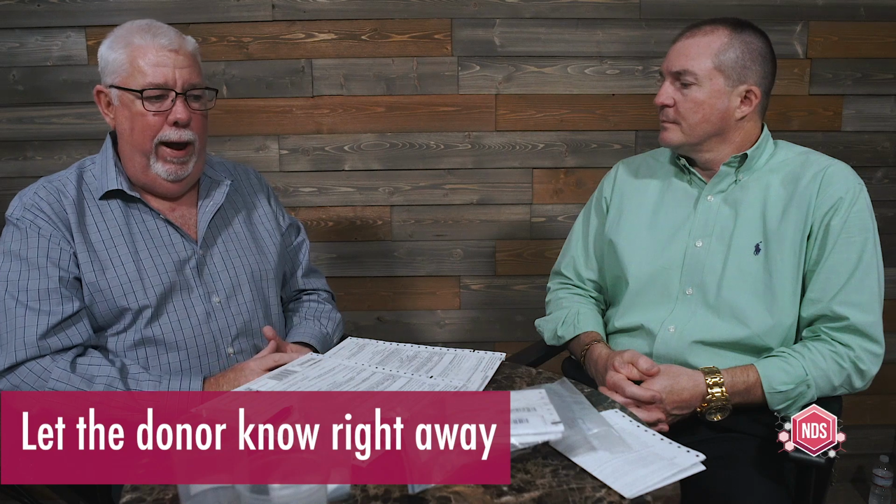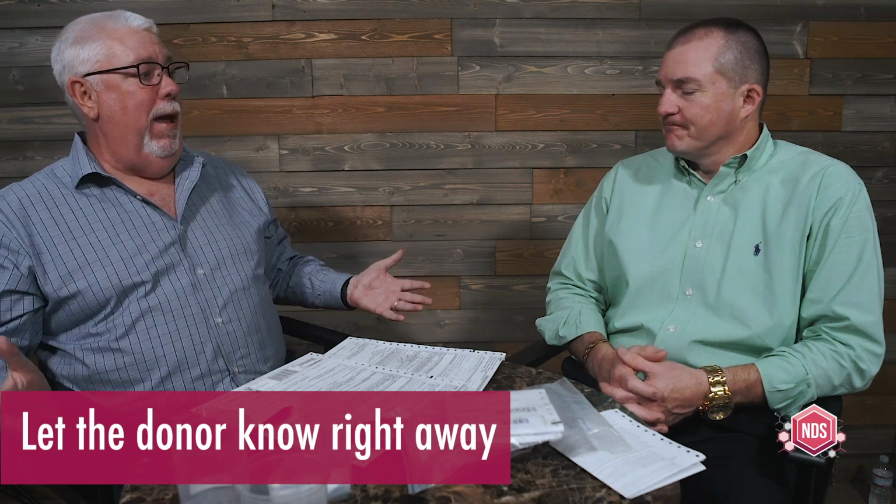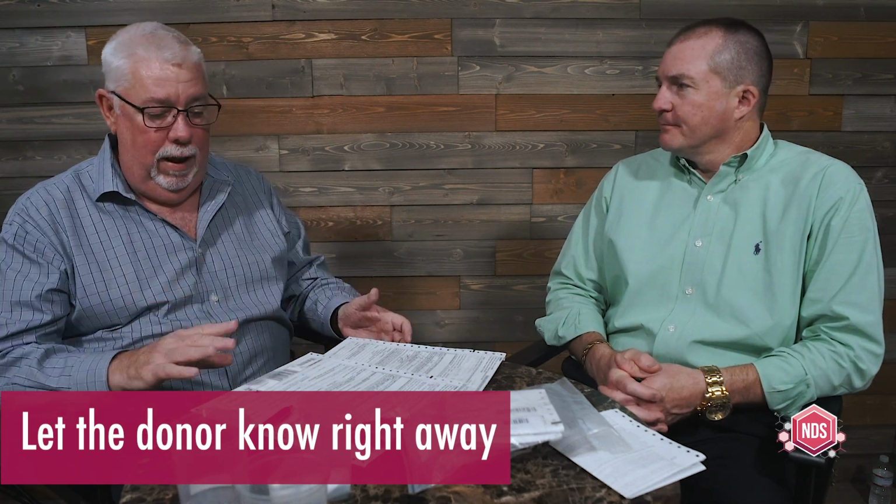Let the donor know right away, because Tom, when I let you know about the direct observation, you may have said, I'm not doing that, right? And in that case, I wouldn't need 2 forms anymore. I wouldn't even need 2 specimens, because if he doesn't want to move forward with that second collection out of range, the event is over and it's a refusal, and I'm going to fill out the paperwork from my first specimen, marking it down that he refused the specimen under direct observation. I'm going to not send anything to the lab, because if I don't have a good specimen to send to the lab, I never send them a bad specimen.